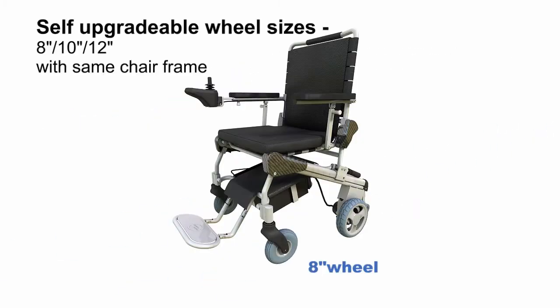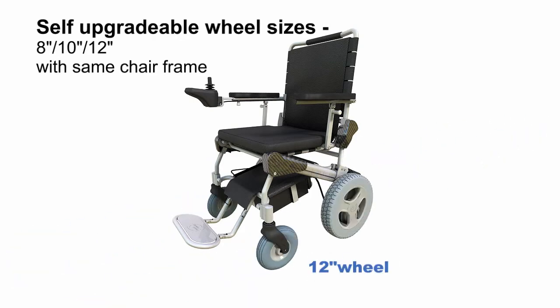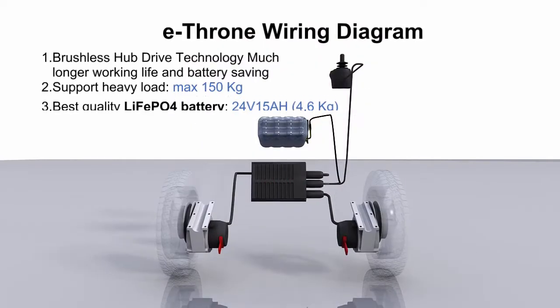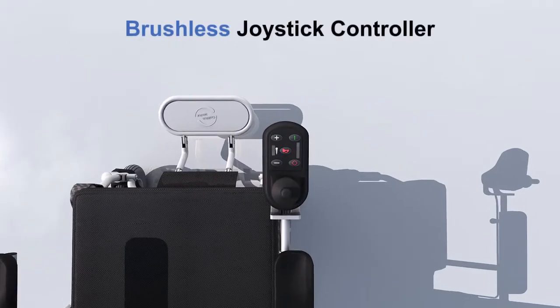Self-upgradable wheel sizes: 8-inch, 10-inch, and 12-inch. eThrone wiring diagram. Brushless joystick controller.